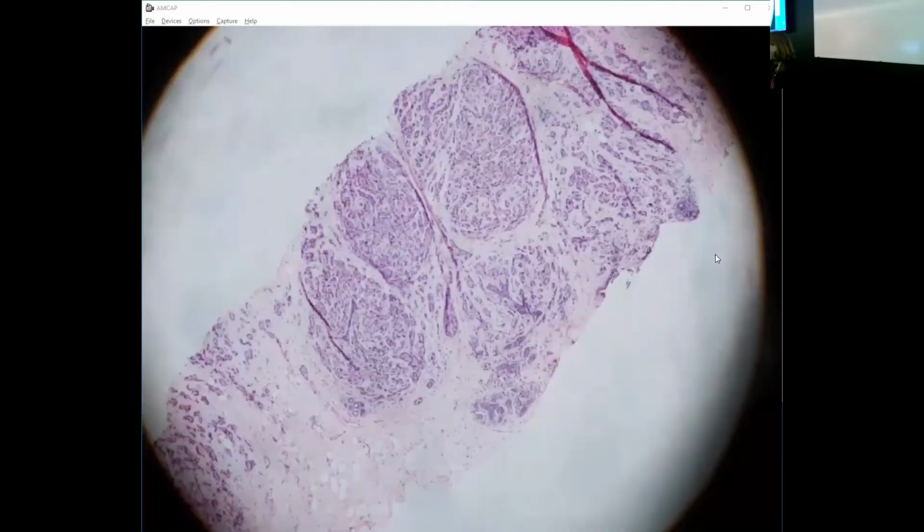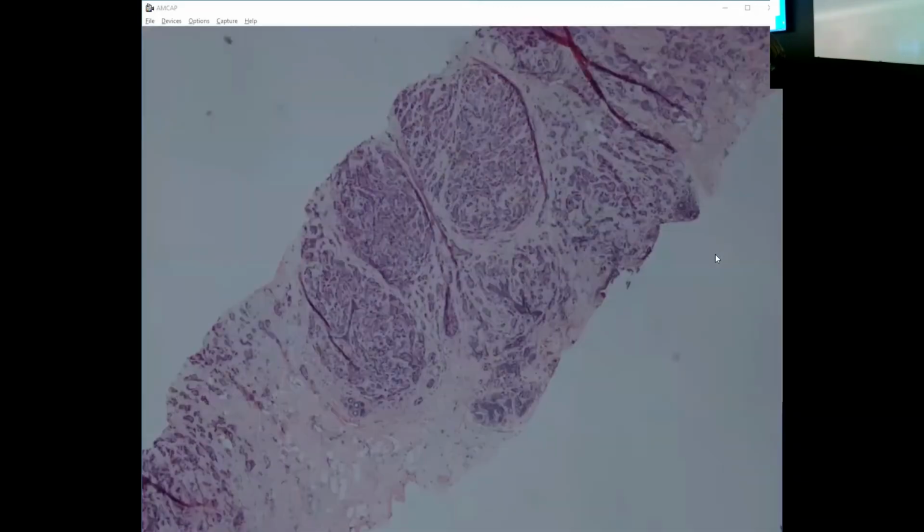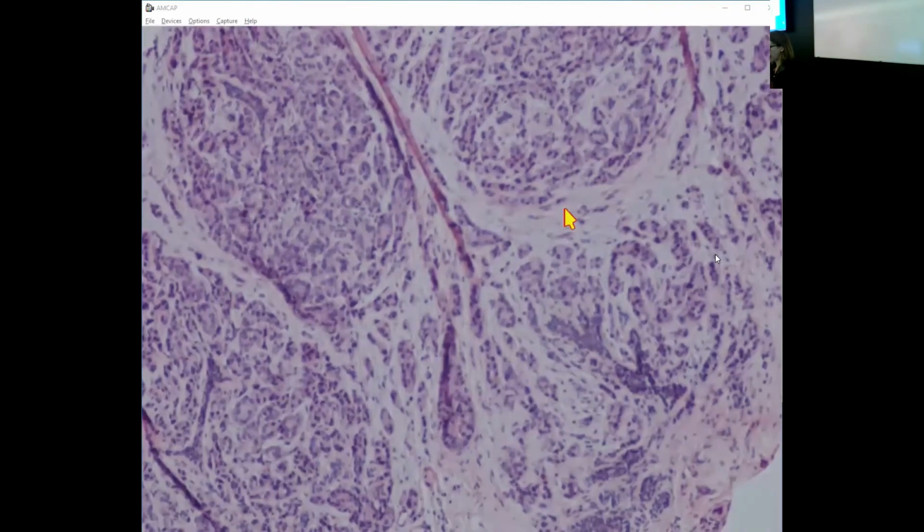No. Okay. So here, this is a core needle biopsy for a mass lesion or something, an image detected finding. And I think this is tricky because what does it look like we have here? I'm going to lead you down the garden path, but how would you describe these sorts of areas? Yeah, it looks kind of lobular-centric, I think. So to begin with, a low power first look is sort of adenosis I'm thinking about, right? And even on higher power, you might think about adenosis.